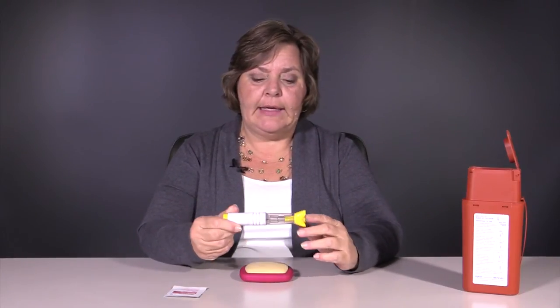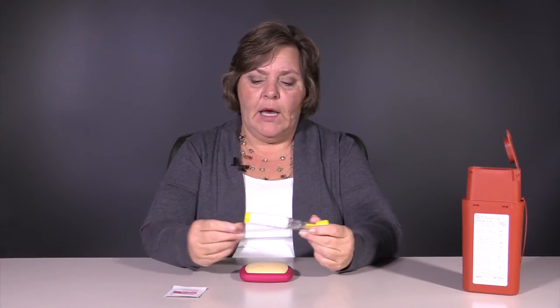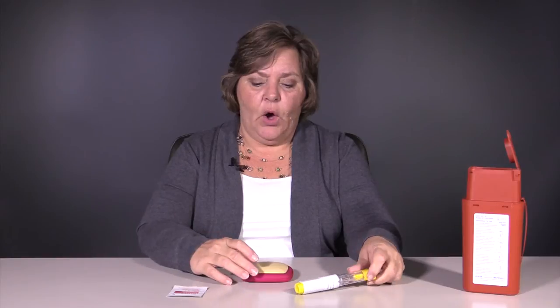Hi, today we're here to learn how to self-inject Resuvo. Resuvo is an injectable methotrexate, and it's administered through a self-auto-injector pen. All you will need is an alcohol wipe. If you do not have an alcohol wipe, a bottle of rubbing alcohol and a cotton ball will suffice, and your pen.